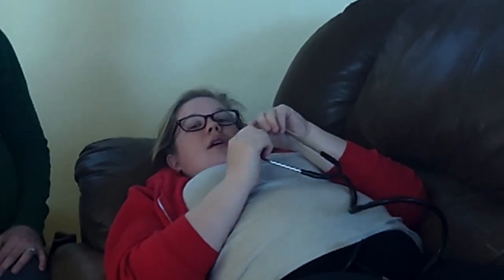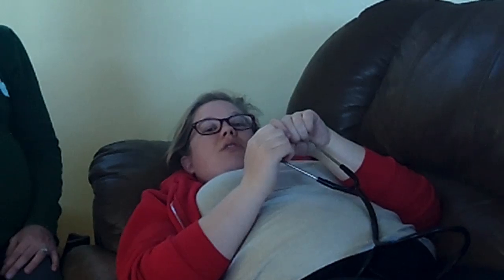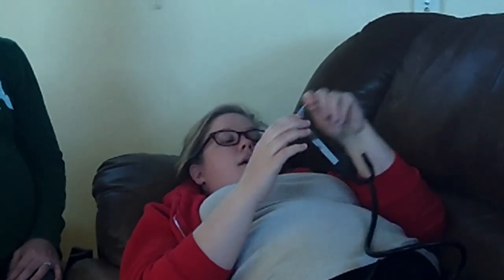Anything else before I... So how about what do you do before you lay down? Right. So you probably want to go pee, empty your bladder before you start, just before you're poking all over in there. Quiet. We need quiet. Yeah, a quiet room.